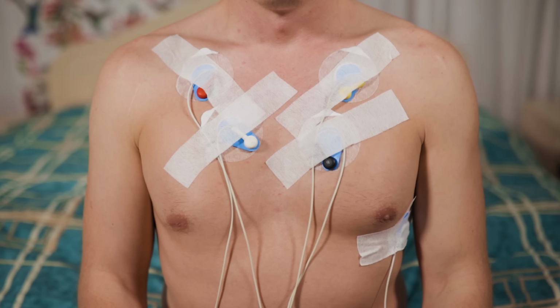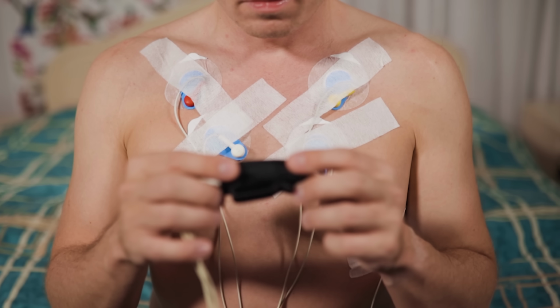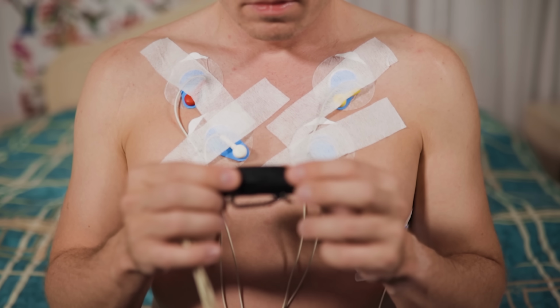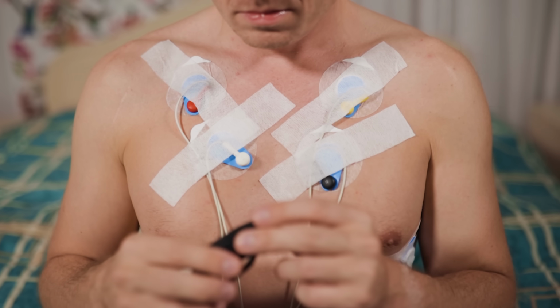What happened with your heart at the time? I can tell you about half the time, on average, over doing this for many years, people write stuff and it's not a rhythm disturbance. They're feeling something else in their chest. But the other half, they write something and yep, lo and behold, there is something there. And then we can provide some guidance. Many times it's actually nothing to worry about. Extra beats from the upper or the bottom chamber of the heart. Occasionally it is something to worry about, and then we have to deal with it.